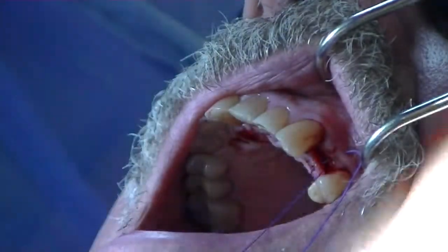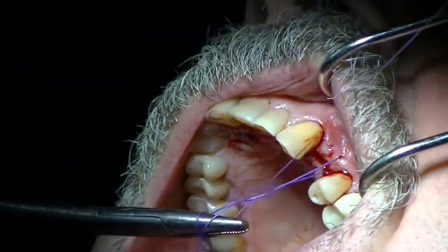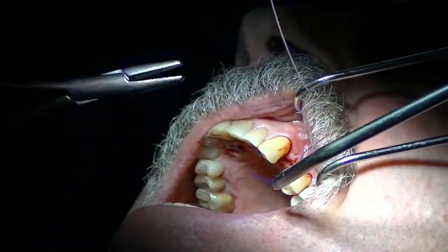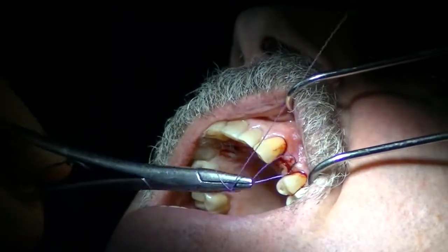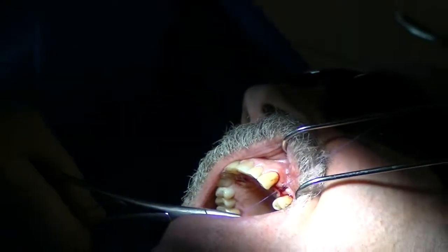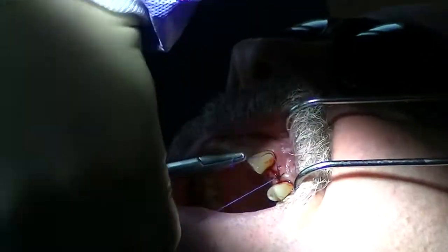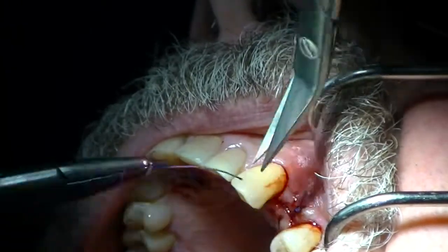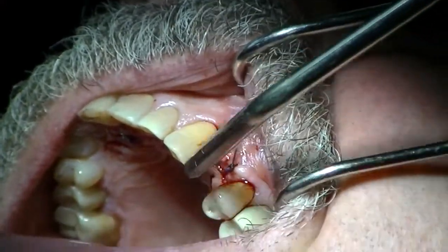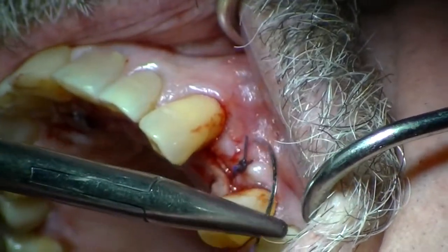Yeah, I'll just do a couple interrupteds here. 2 forward, 1 in reverse, 2 forward, and then you can snip that up. And let me do 1 more here. Very, very nice sutures. And 1 more here.